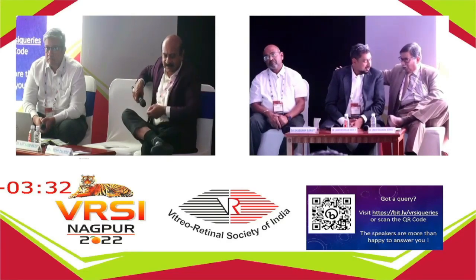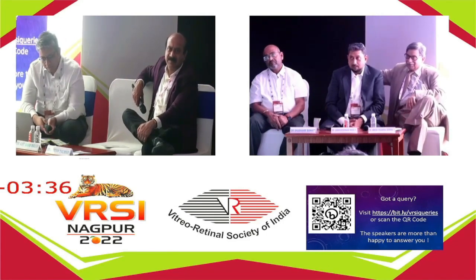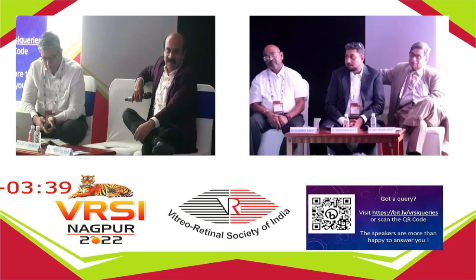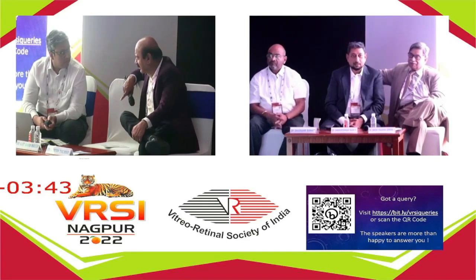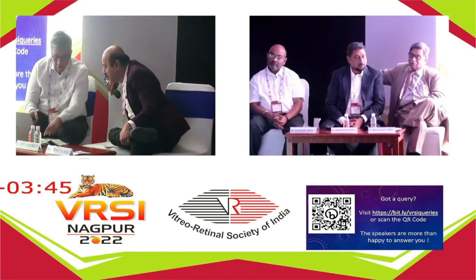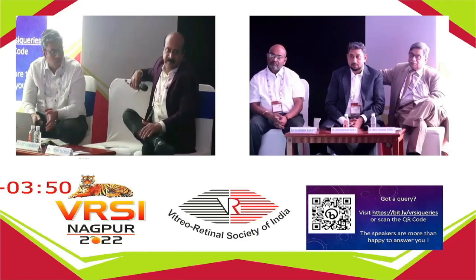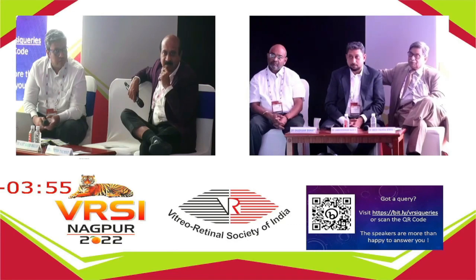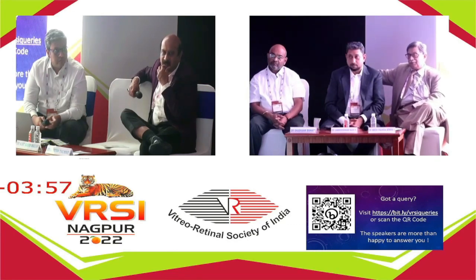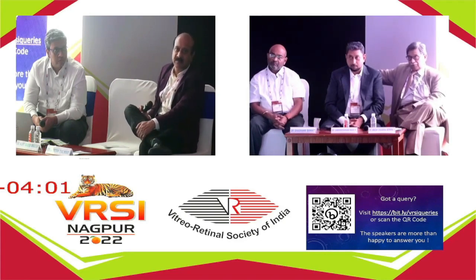One, in OCTA, you're actually seeing not a lack of flow, but a slow flow. So you have to bear that in mind, because this is important information, especially when treating patients with RVO and diabetes. But I think today it's really difficult, as you mentioned, to live without OCTA. And when you're doing that, you're not only using OCTA, you're using cross-sectional B-scan OCT, and also en face. En face gives a lot of information that we're not commonly using here.